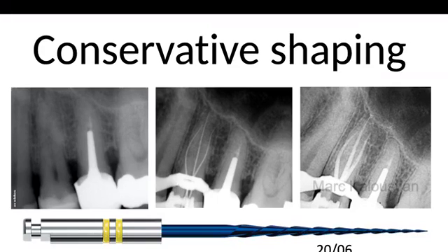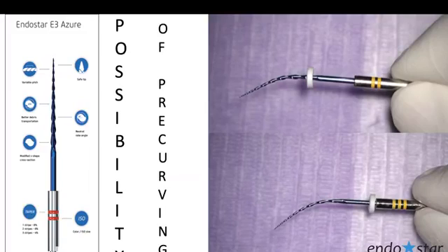That's why on this upper premolar, for example, you can see that I didn't enlarge too much the canals because I didn't enlarge also too much the coronal part of the tooth, the access cavity. And at the end, I can have a shaping that is not very large, very small apical diameter because the anatomy of the tooth give me the opportunity to have the small apical diameter, and a good shaping at the final with this one instrument, which is the 2006.